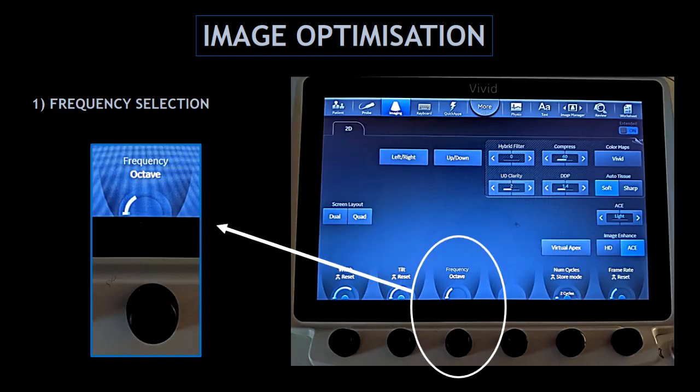This is the main screen of the GE E95. At the bottom, you can find the frequency selection.